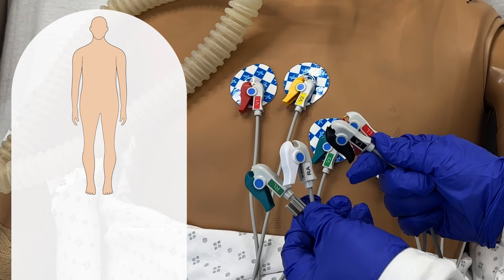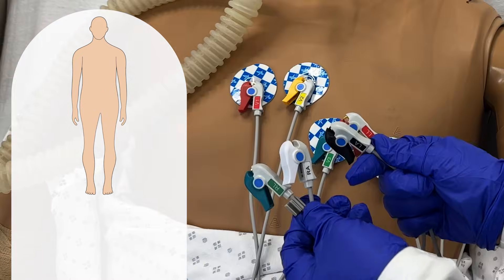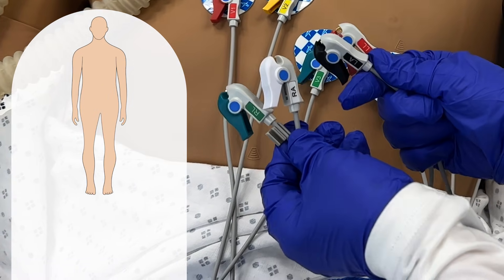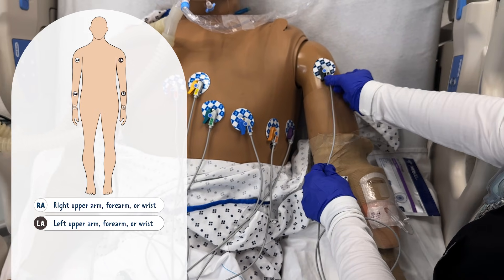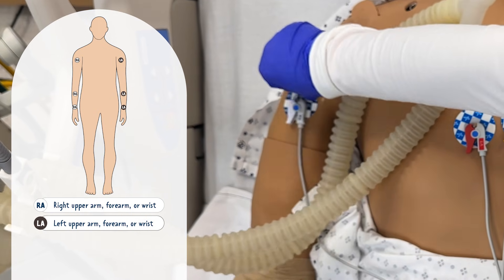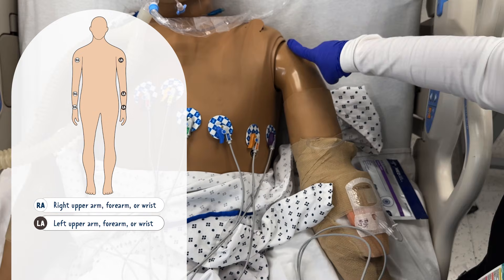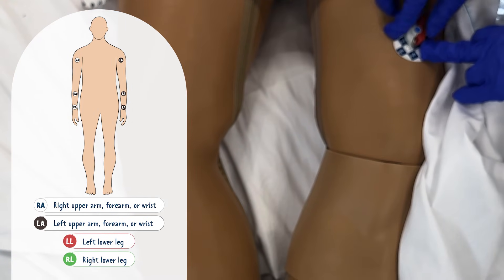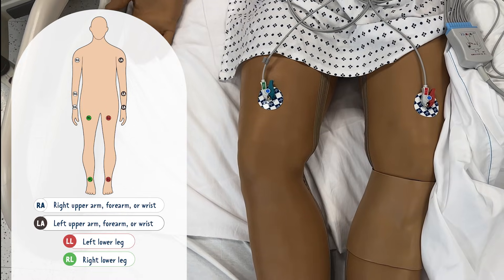Now let's place the four limb leads. We call these limb leads because they're placed on the limbs. You can look at the lead labels to identify left arm, right arm, left leg, and right leg. Arm leads can be placed on the upper arm, forearm, or wrists — for this placement, we'll put them between the shoulder and elbow, ideally on the upper bicep or deltoid for easy access above the patient's gown. Leg leads can be positioned anywhere from the thighs to the ankles. Make sure they're symmetrical and avoid placement over bone.